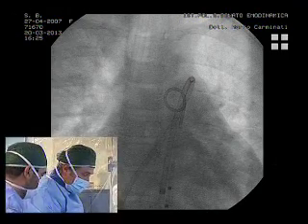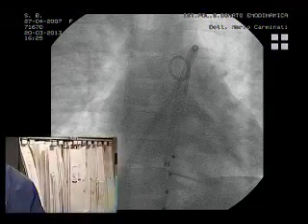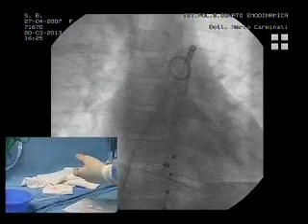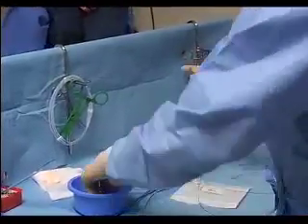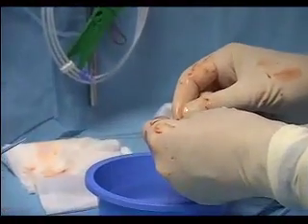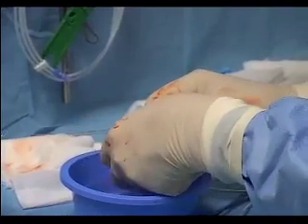Yeah. But with the AVP2, the advantage is, and I beg to disagree, the cable has nothing to do with it. I think it has a lot to do with the angulation. And that angulation, you are forcing with that cable, you are forcing the device. Let's see the table. Where you have that cable that is very thin. For the AVP2, it adapts to the anatomy rather than following the strength of the cable release. Yeah. I think the point I wanted to make is just in case he's got the wire for the ADO2AS out and wants to use it, it's not compatible. Yeah.